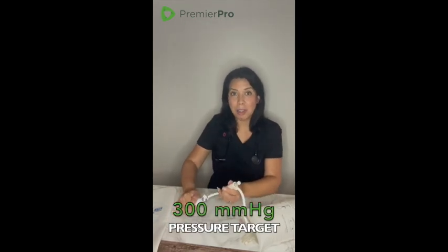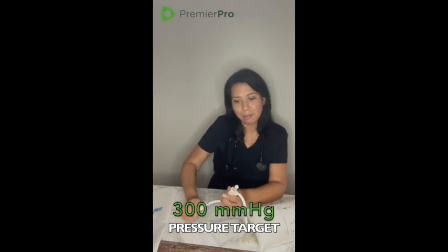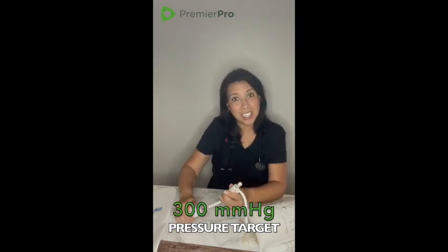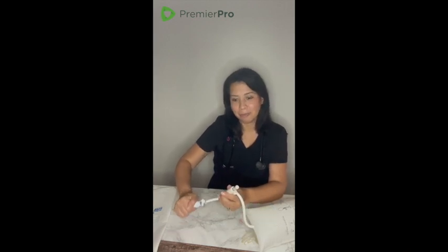As I'm inflating, I want to make sure that I'm keeping an eye out on my pressure gauge. I'm aiming for that target green zone of 300 millimeters of mercury. Once the green is visible, I know I'm in the zone and I can go ahead and stop inflating.